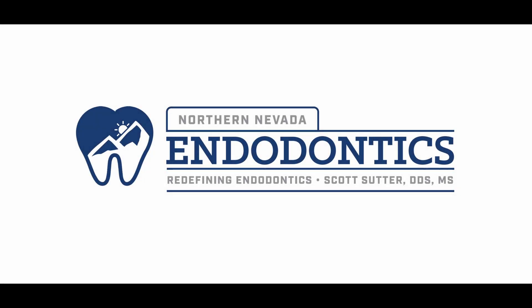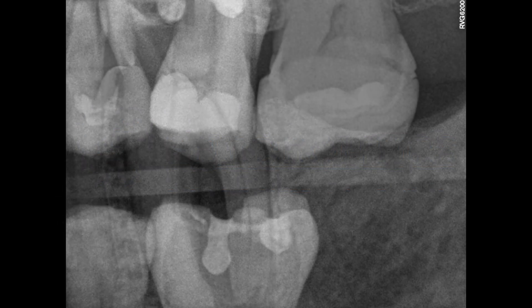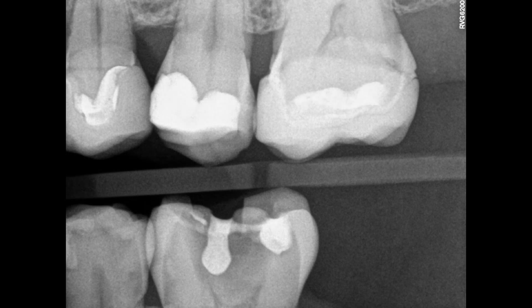Hello everyone and welcome back. Got an interesting one for you today. When I first saw this, the first thought was, oh no, that tooth is cracked. That's not a good pattern of bone loss. You can see the caries on top though. So it made me think, okay, let's go ahead and take a look at this tooth.